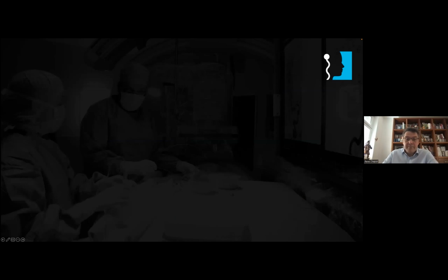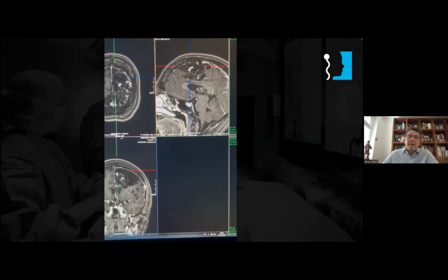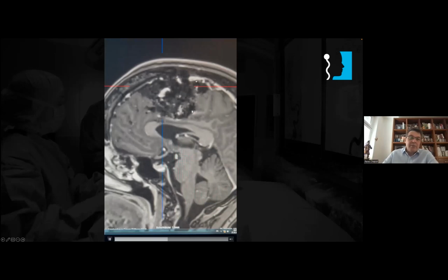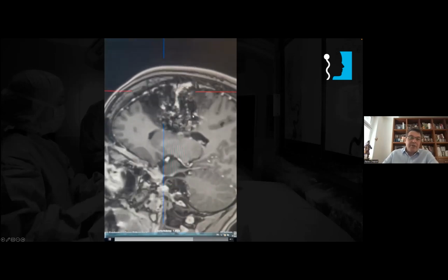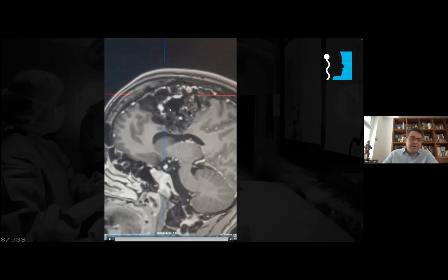So, I see the time is running. Maybe a very short image to show you this. In a patient where there is a lot of Onyx, it may be extremely difficult to see where the veins are. And sometimes the best way to see it when there's too much Onyx is to do this T1 MPR imaging, where you see the veins. Here is one vein, and here's a second vein that you can see. Unfortunately, DSA is not good. So we need a combination of DSA and MR to see those veins, to be able to access the vein and cure this AVM.